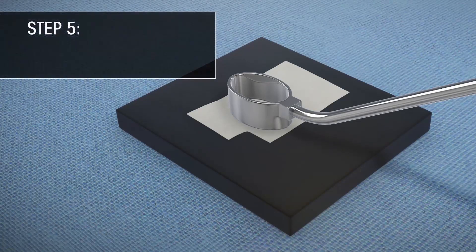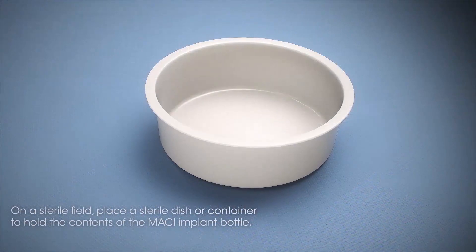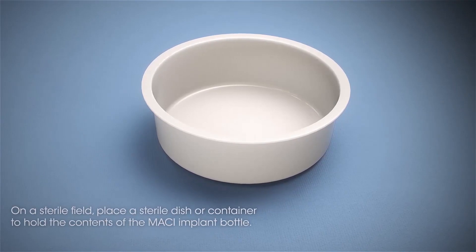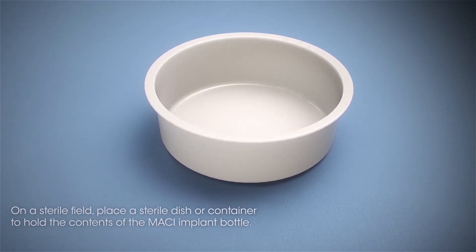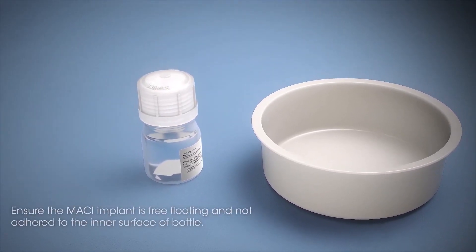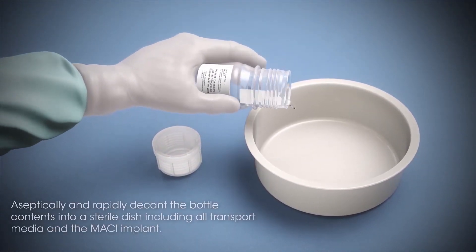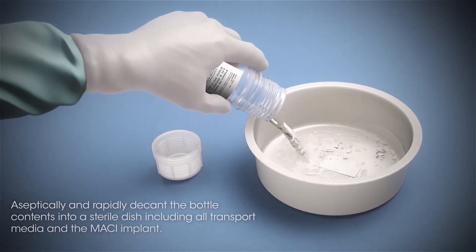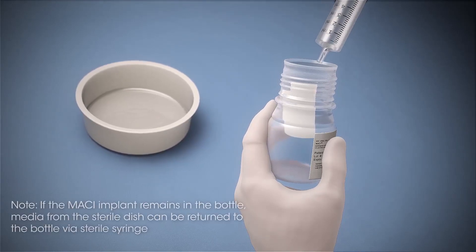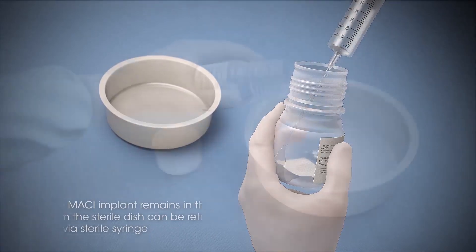Step 5: Shaping the MACI Implant to Match the Defect Size. On a sterile field, place a sterile dish or container of sufficient size to hold the contents of the MACI Implant bottle — approximately 120 mL of media. Ensure the MACI Implant is free-floating and not adhered to the inner surface of the bottle. Aseptically and rapidly decant the bottle contents into the sterile dish, including all transport media and the MACI Implant. Note: if the MACI Implant remains in the bottle, media from the sterile dish can be returned to the bottle via sterile syringe and decanted again.